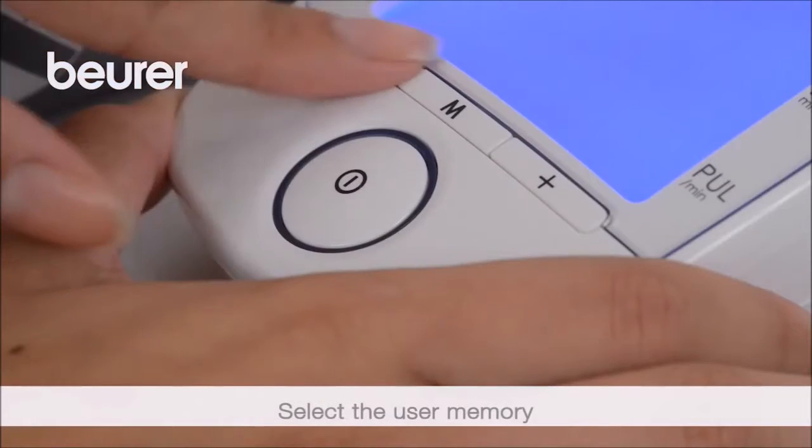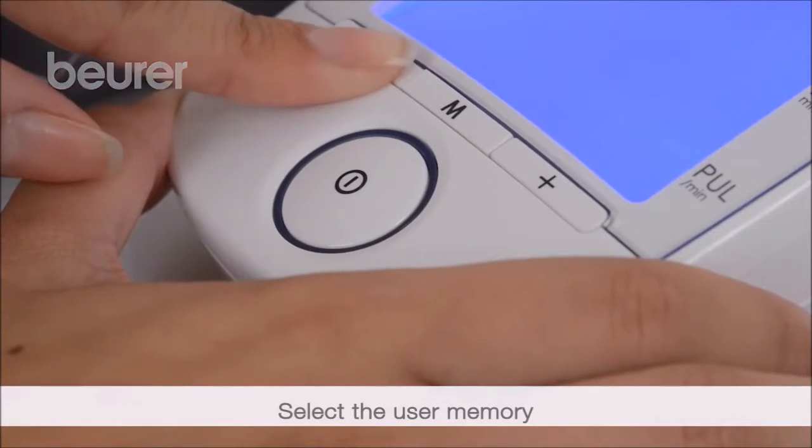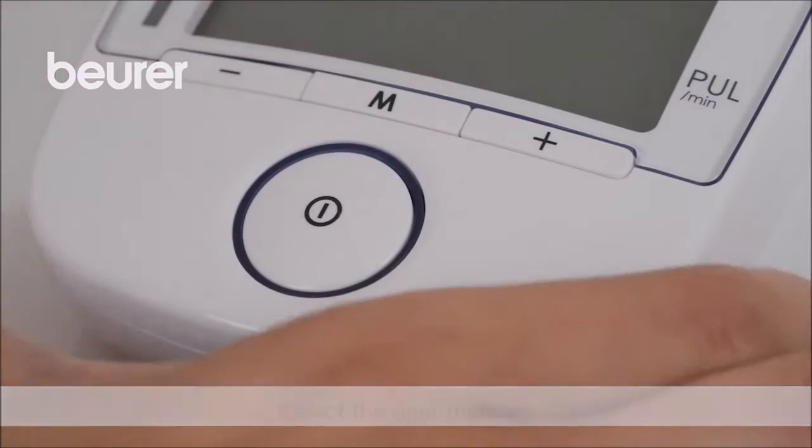Then select your user memory by pressing plus or minus. Press start/stop to confirm your selection.